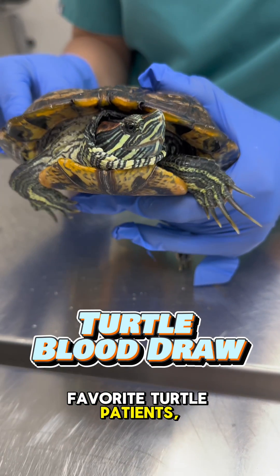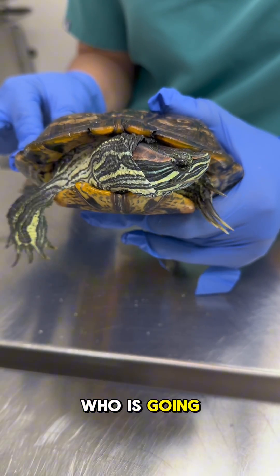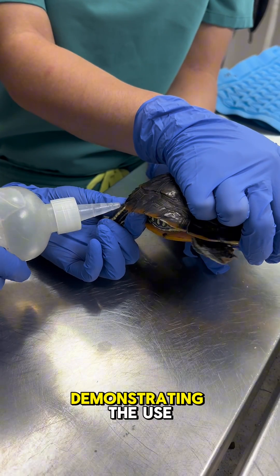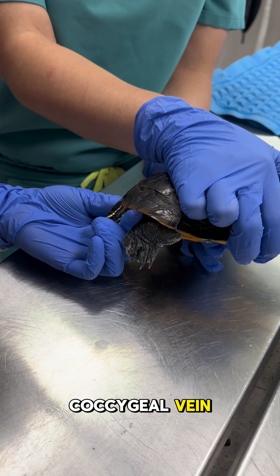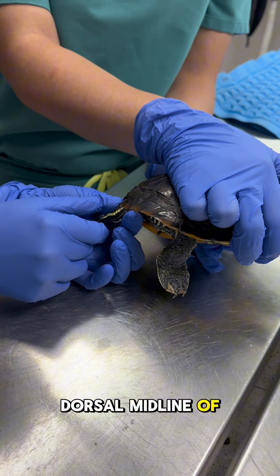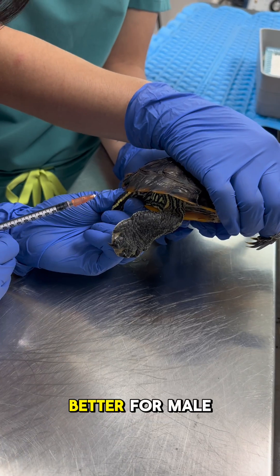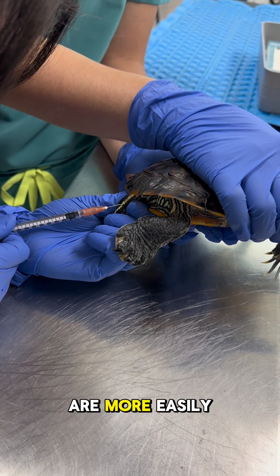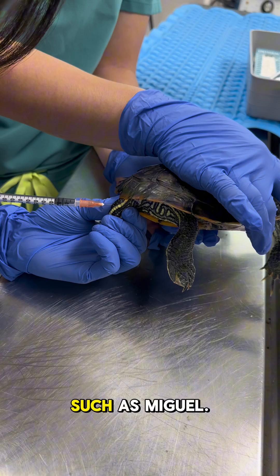Here we have one of my favorite turtle patients, Miguel La Tortuga, who is going to help us demonstrate how to draw blood on a turtle. For this video we will be demonstrating the use of the dorsal coccygeal vein, which can be found on the dorsal midline of the tail. This method works better for male turtles as they typically have longer tails, and turtles that are more easily handled and have a good temperament, such as Miguel.